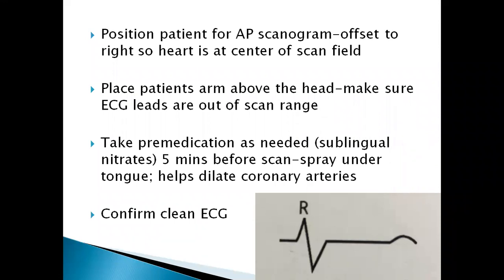Whether the patient goes in feet first or head first doesn't matter. It depends on your departmental protocol. Our patients go in feet first. The most important thing, however, is to make sure that the patient is in supine and that the patient is calm. The patient is offset to the right so that the heart is centered in the scan field, and the patient's arms are placed above the head.